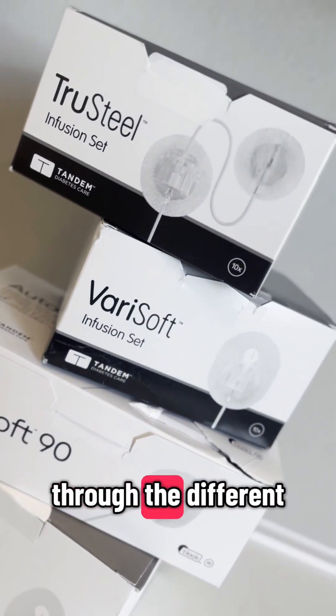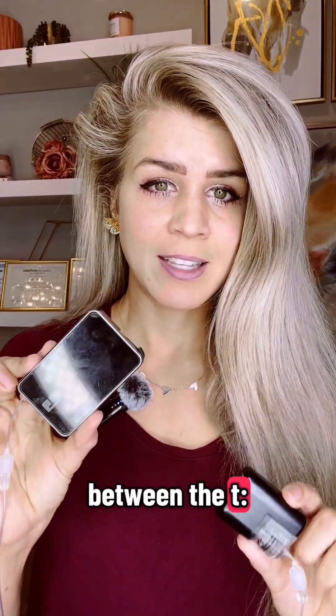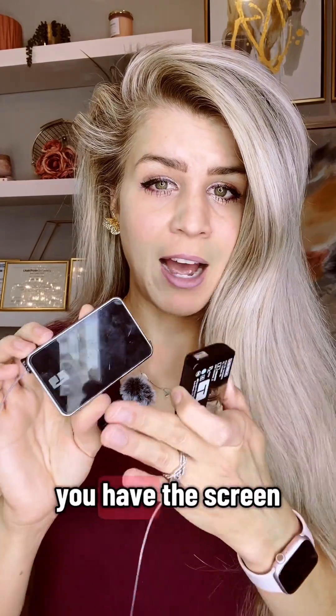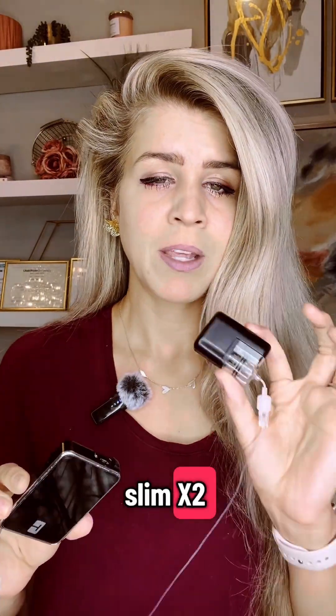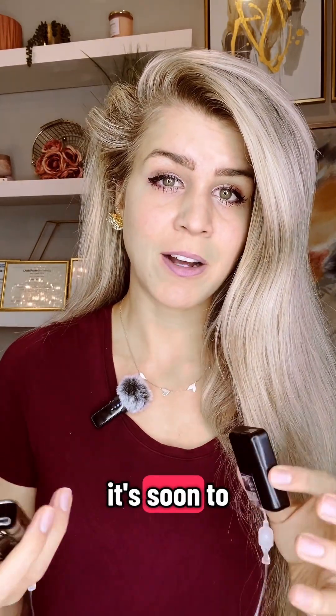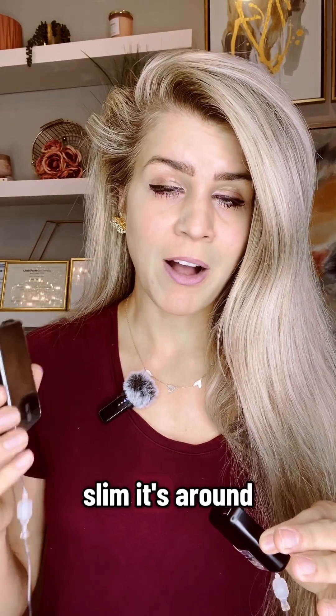In this video I'm going to go through the different options with the Tandem pumps. There's the t:slim X2 and there's the Mobi. The main difference between the t:slim and the Mobi is that you have a screen and you don't need a phone with the t:slim X2. With the Mobi, you have to use your phone — right now it's only working with iPhone, but it's soon to also connect with Android.